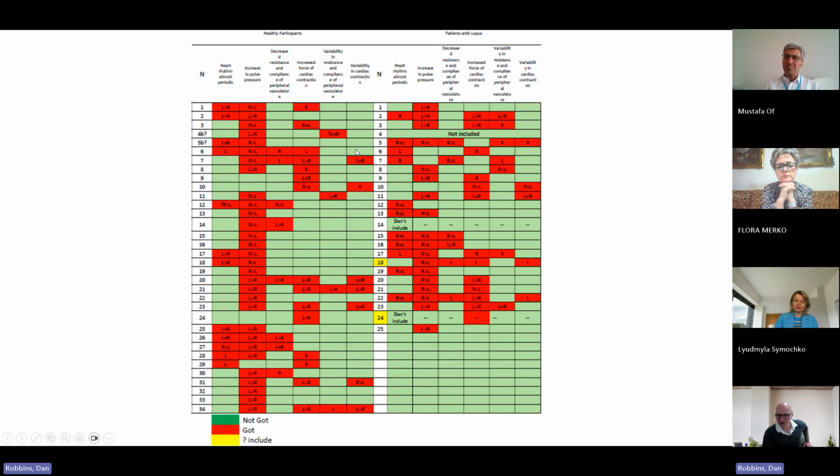there always seem to be some observations, which is really rocking my faith in the concept that this is something you can just use, put a PPG sensor on, and then look at the same way you would an ECG.